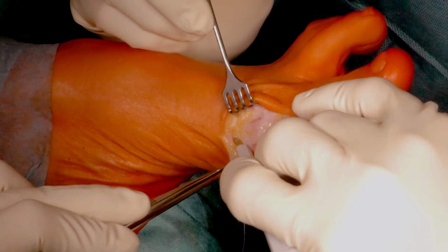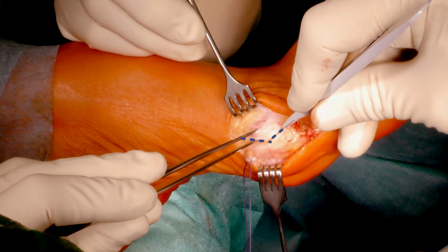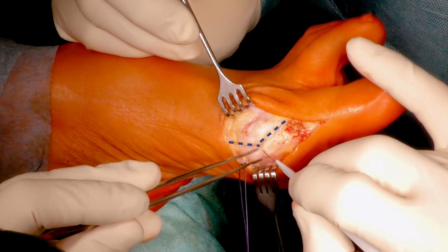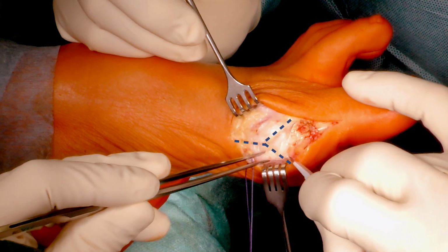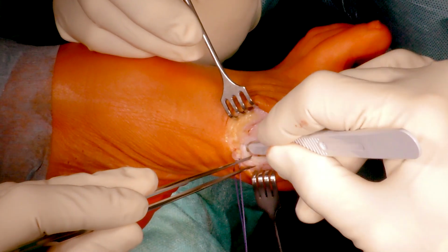Joint preparation. A Y-shaped cut of the capsule is performed to allow for a better adjustment of the excess capsule at the end. Joint plica or capsule duplications should be removed.